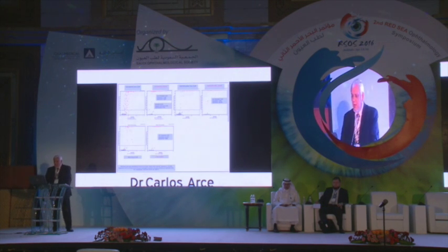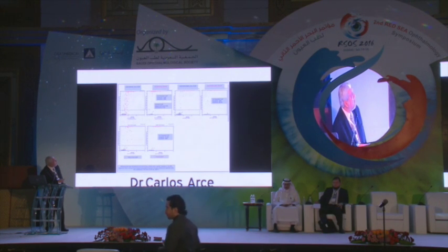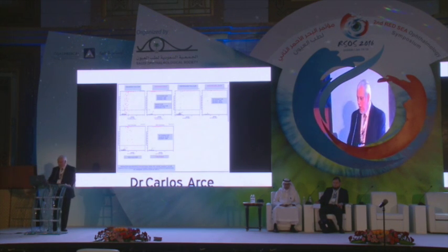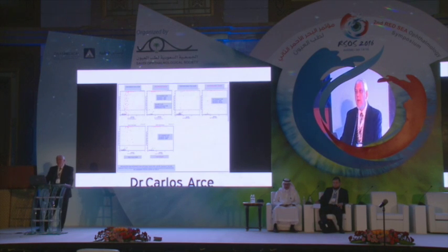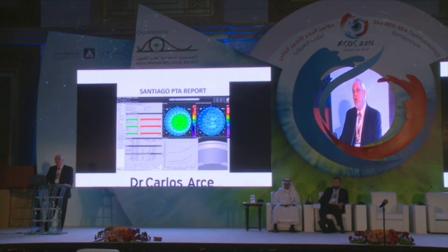And you can see that in Colombia, the discrimination was 100% between normal, suspects and keratoconus, in Switzerland was 99%, by Dr. Koch in the United States is 98%, 97%, and 100%. So the possibility to discriminate keratoconus and normal corneas presently is not a problem.